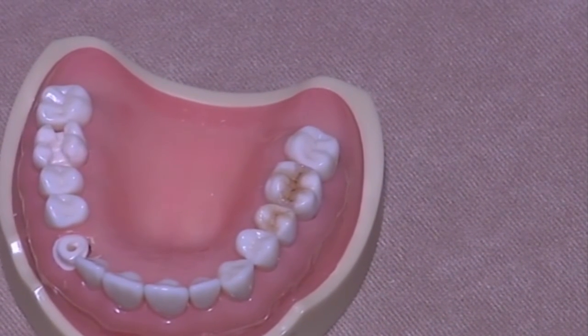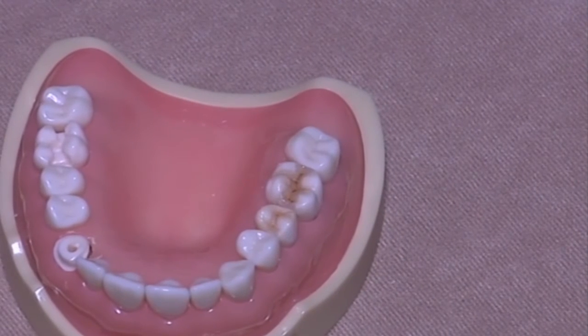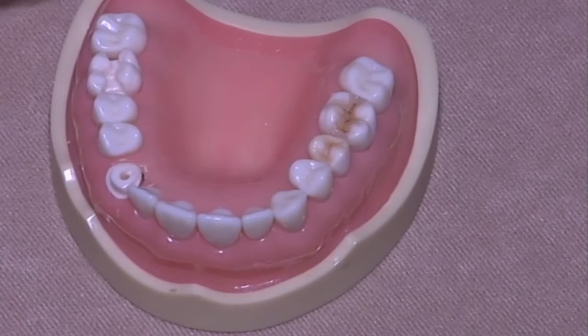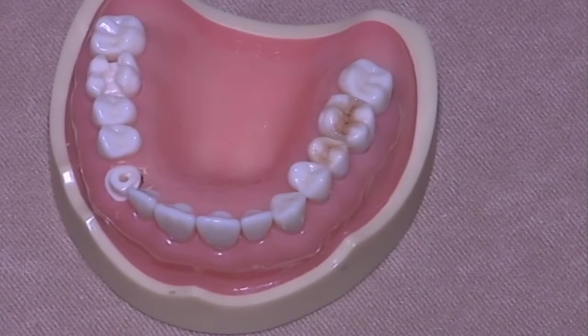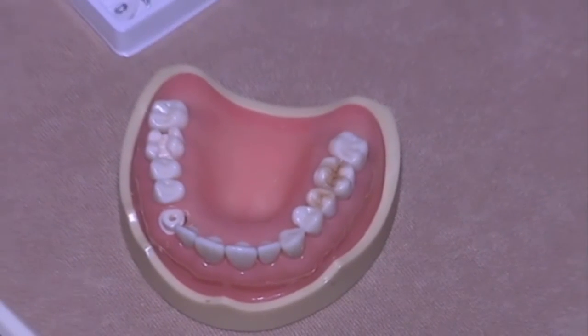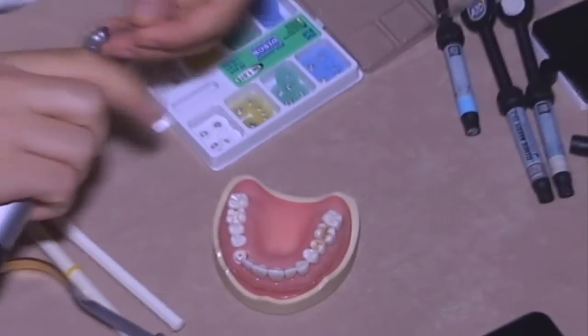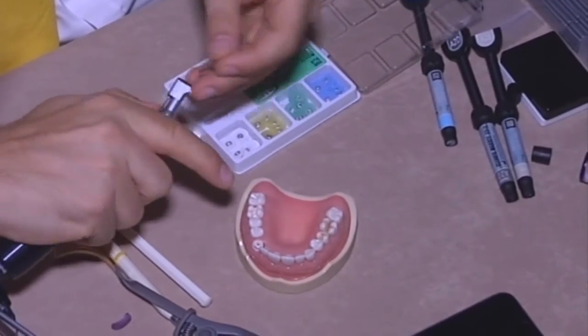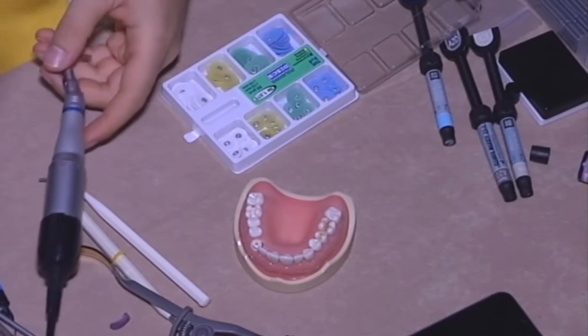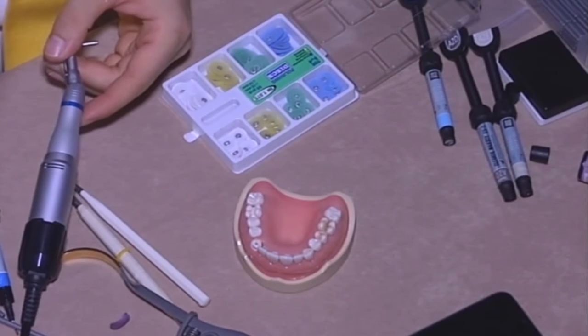In posterior second class restoration, for finishing procedures, I always use discs, always. Okay, it works.